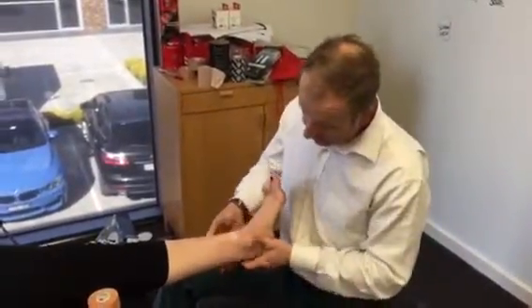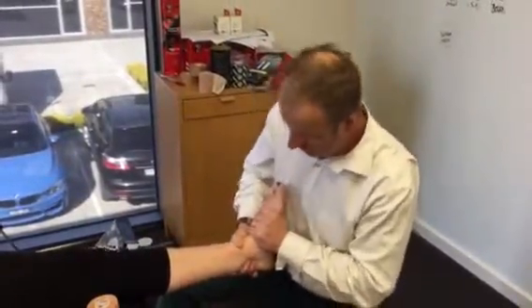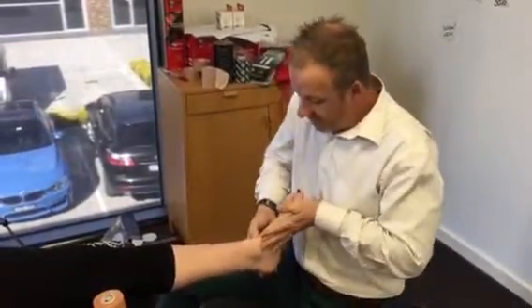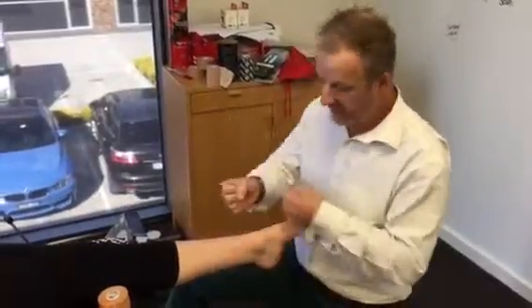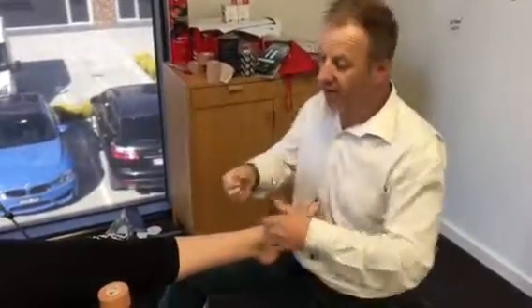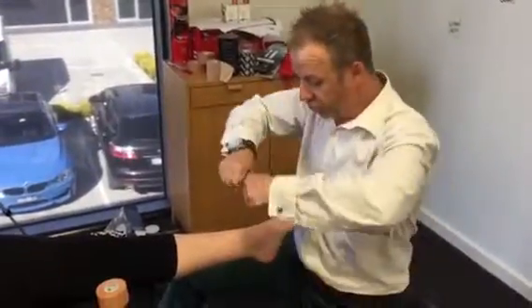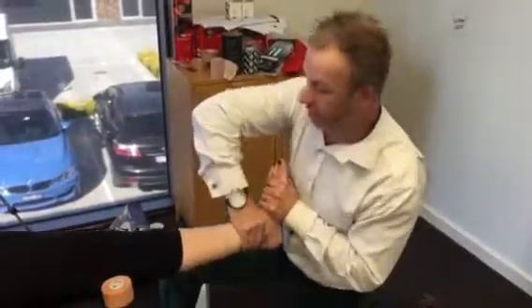Sometimes what happens is this bone here — the tibia that comes into the talus — can glide from posterior to anterior and start to jam the retinaculum, the talar neck, the tibial plafond. There are a few structures in here that can be compromised if the ankle is shearing the wrong way. So we want to try and reproduce the good mechanics of the body to keep that tibia back where it belongs so it doesn't glide forward.